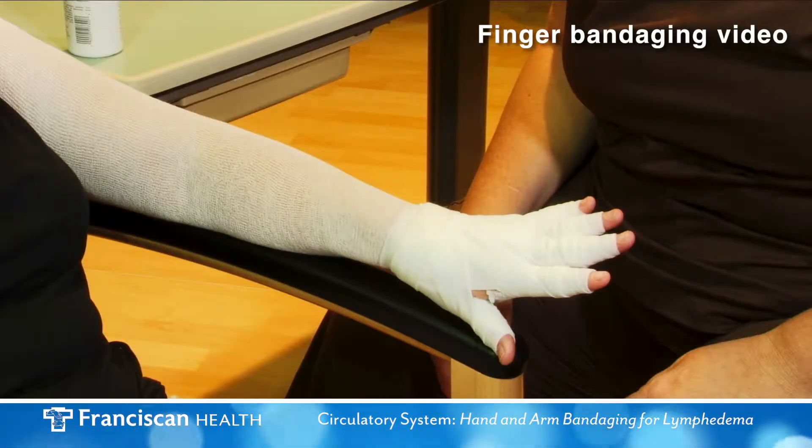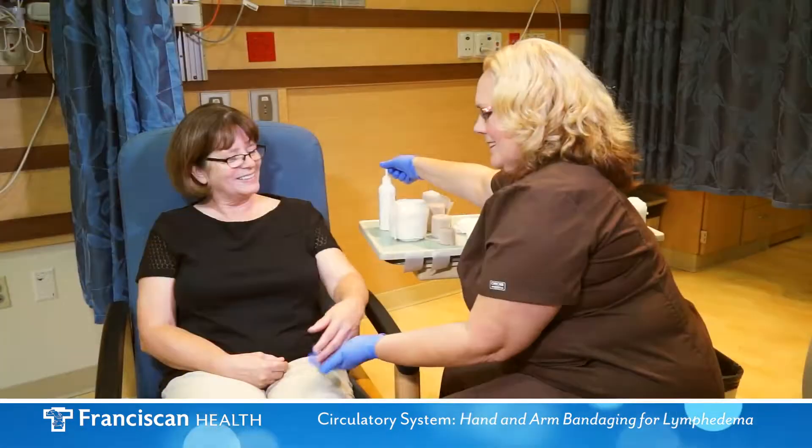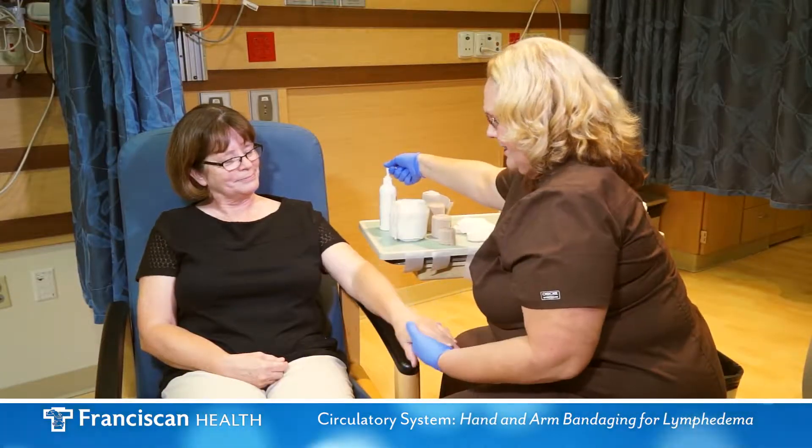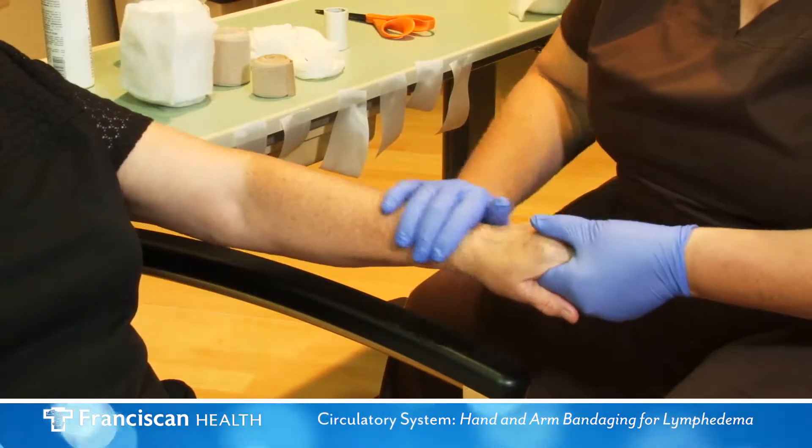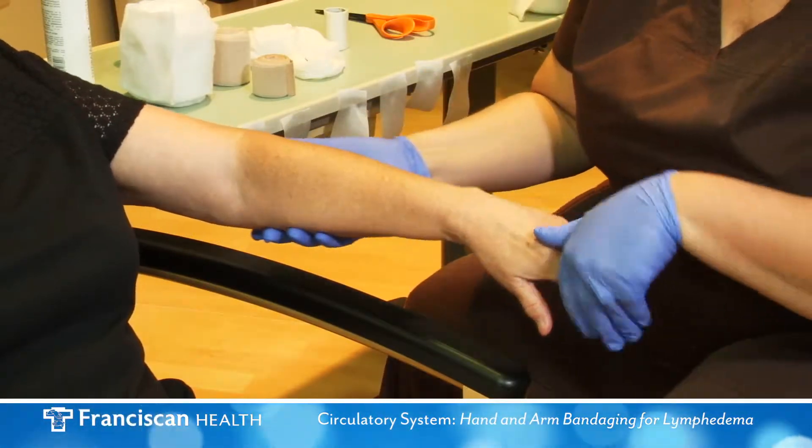After first cleansing the skin with mild soap and thoroughly drying the area, apply low pH lotion, fragrance free and dye free, such as Eucerin or Elta.